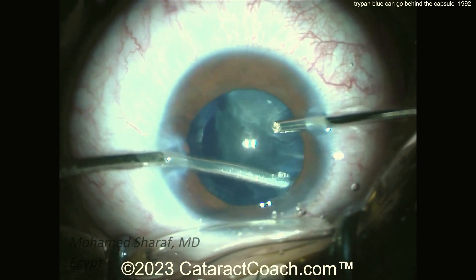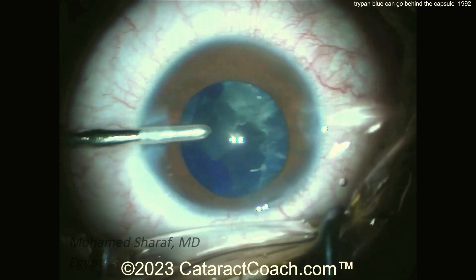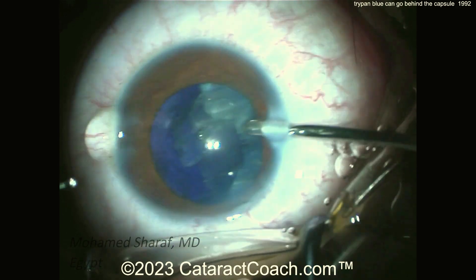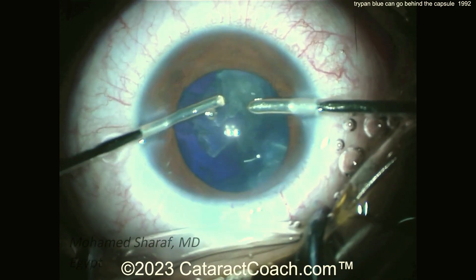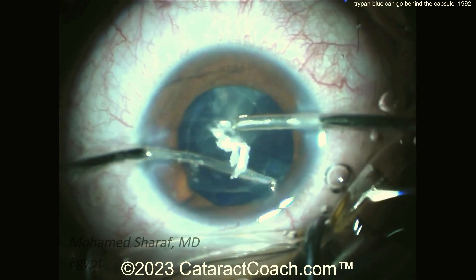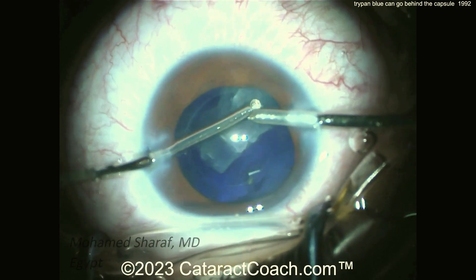You can see our guest surgeon did a beautiful job using a bubble in the trypan blue dye syringe — first the bubble went on the eye, then just the bare minimum amount of blue dye followed. That bubble helps minimize the amount of dye needed. Now switching hands for the rest of cortex removal, and really not much of a red reflex — you have a blue reflex, because the light coming at you is going through the blue dye in the anterior hyaloid face in Berger's space.